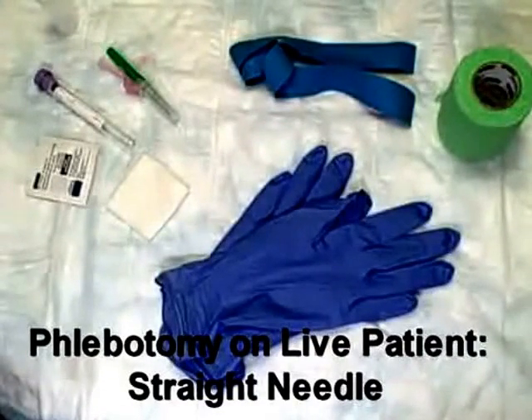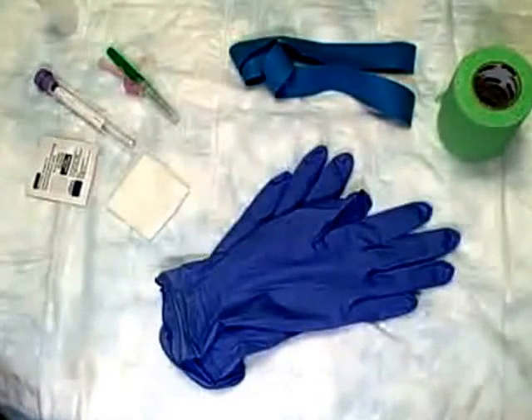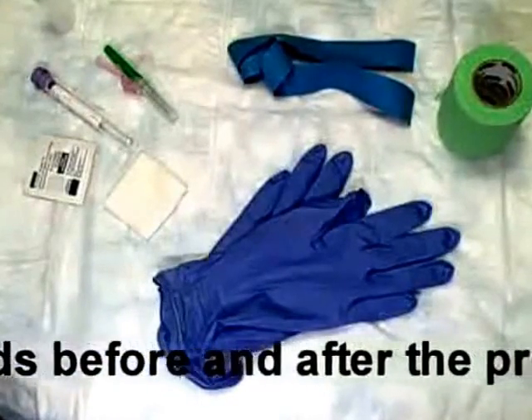Today we're going to be performing phlebotomy with a straight needle on a live patient. The most important part of any procedure is making sure that you have the appropriate equipment before you begin, so today we have gathered our equipment and set it out.